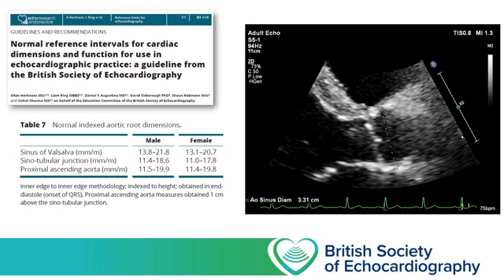Now, as I've stressed a number of times during these lectures, focus studies are supposed to be performed quickly, and intentionally there's few measurements within the minimum dataset. If you want to quickly eyeball the size of the aortic root, compare it to the left atrium and right ventricle, and broadly speaking, these three structures should have roughly similar diameters.